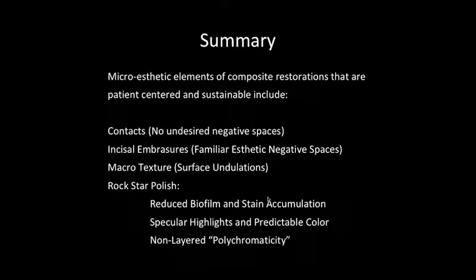And then, of course, the Rockstar Polish, which is to help with minimizing biofilm and stain accumulation, and then giving us the specular highlights, and then the predictable color, and then the non-layered polychromaticity, just depending on how you manage the thickness of that restoration on the facial aspect.